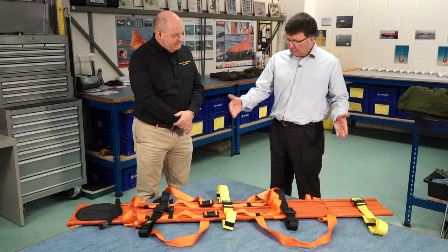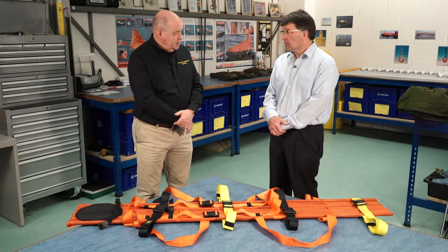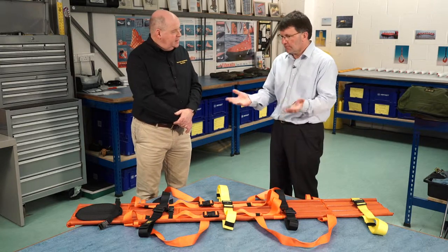And what about the weight of the thing itself when you're carrying it? It's 4.5 kilos. So it's not too heavy then. No, not at all — I was holding the bag just now and it felt pretty light to me.